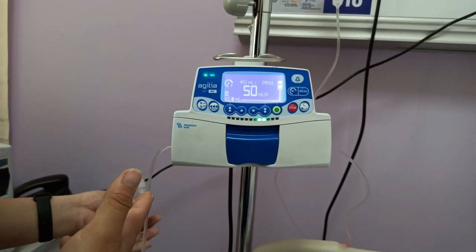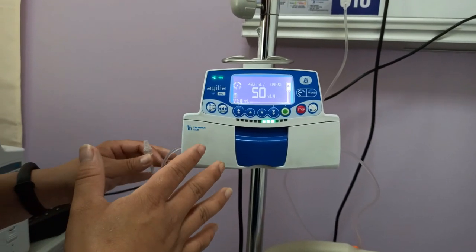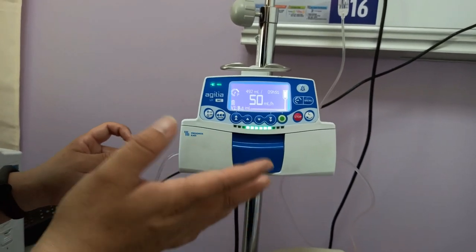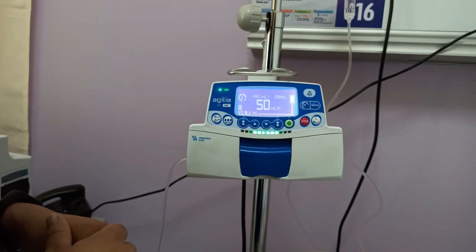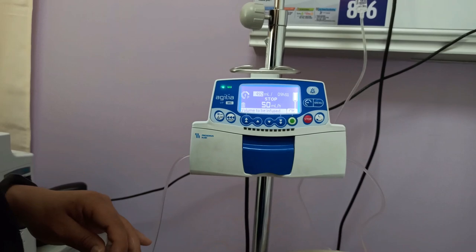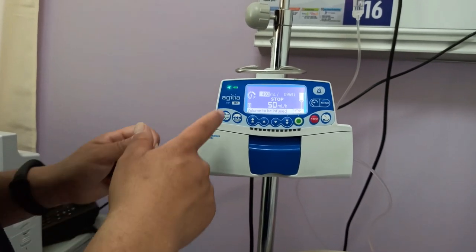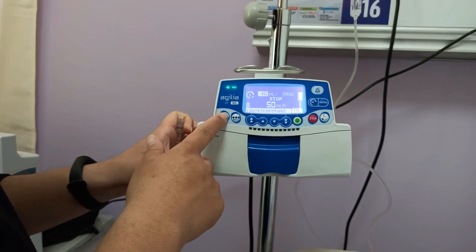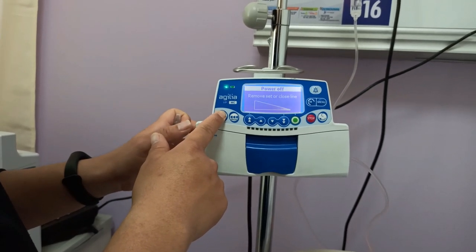When you feel enough bolus has been delivered, release the bolus button and the bolus stops. The infusion resumes at the same flow rate as before. After infusing the desired amount of fluid to the patient, press the stop button to stop the infusion. To turn off the equipment, continuously press the on/off button for a couple of seconds until the equipment turns off.